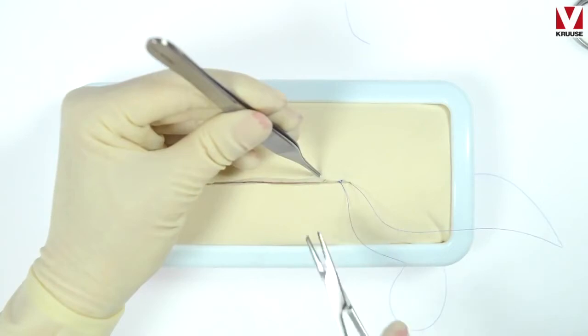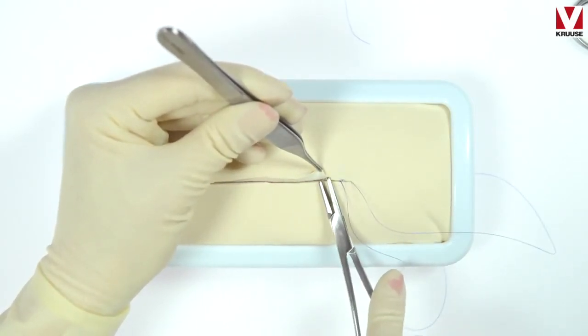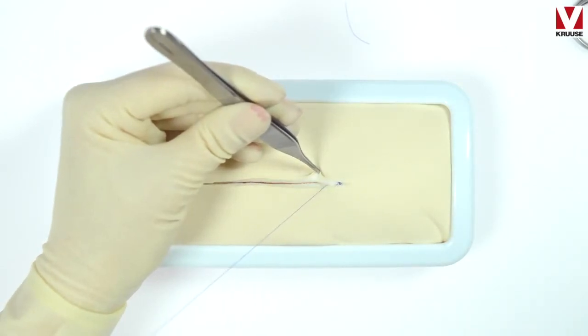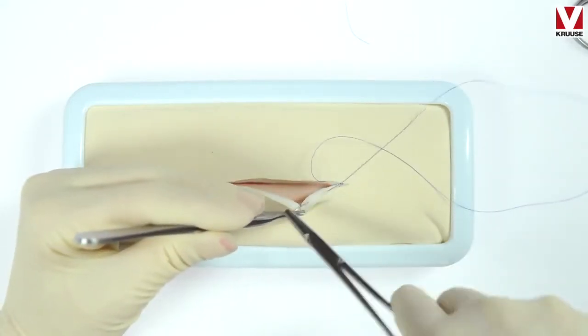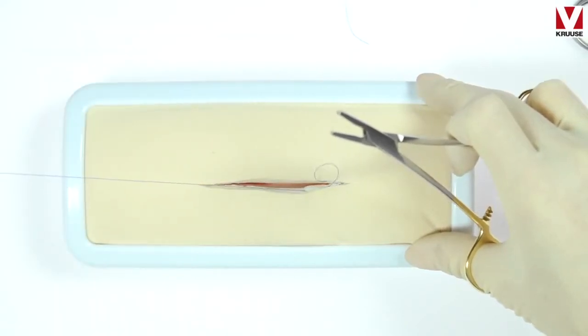It is very important that you don't cut the suture that is already in the wound or the incision with the needle. The needle is very sharp like a scalpel blade. So if you touch the suture with the needle then you have damaged the suture.